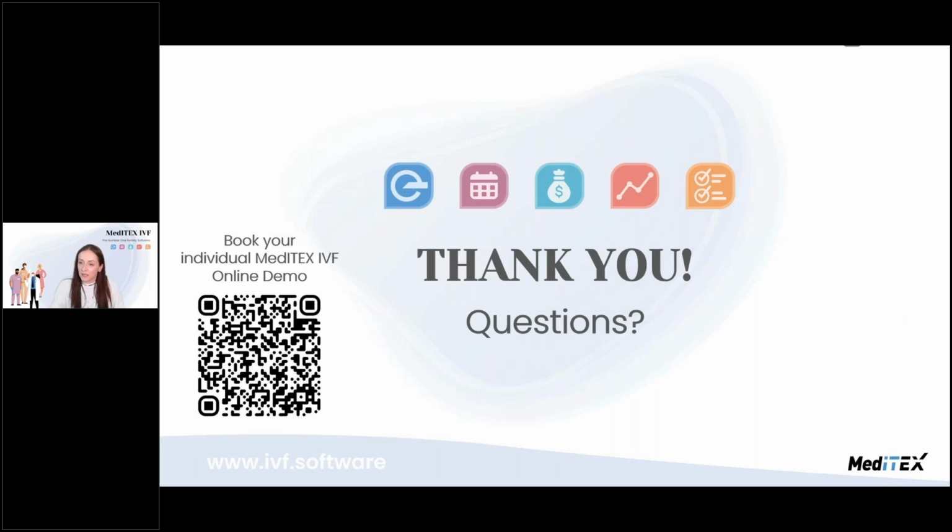You mentioned that MedITEX comes in different languages now. If yes, how long does it take for your team to make those developments? So thank you for your question. Should there be a language that MedITEX IVF is not available in, this really also depends on the help that we get from the clinic, since we do these translations together, but this shouldn't take longer than a month. Because this really is just a translation and not a development per se.